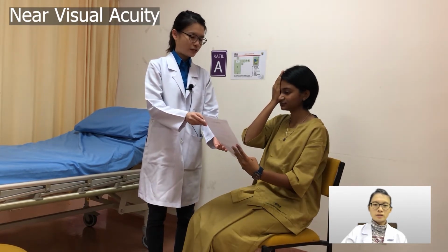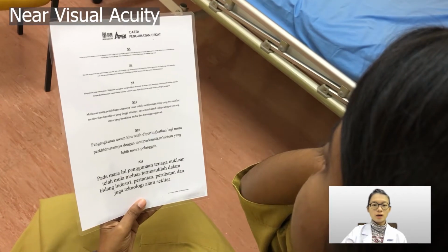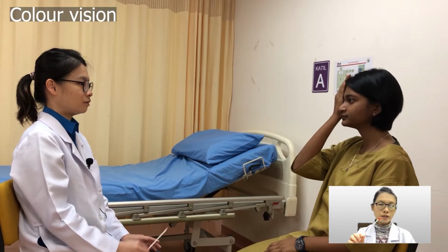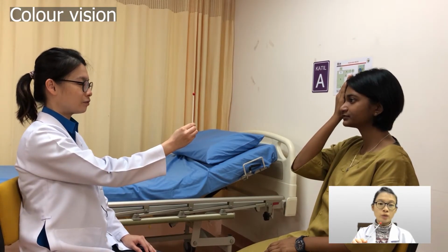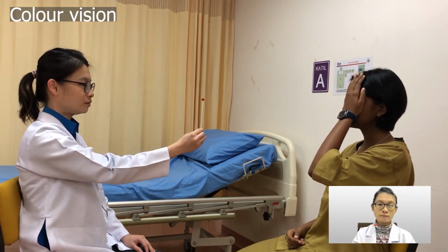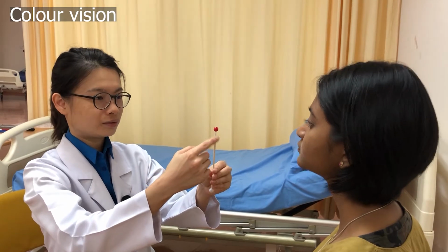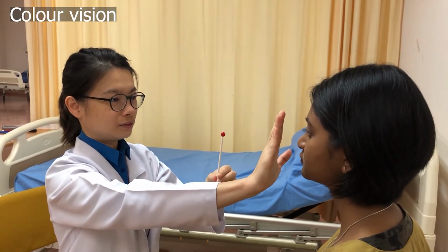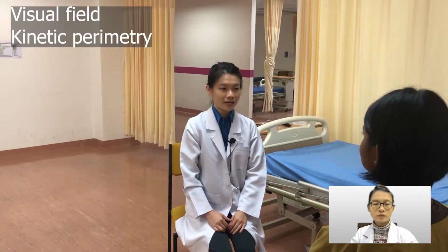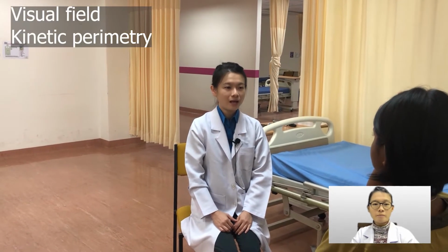Ask the patients to hold the near vision chart at her routine working distance or at a distance of 30 cm. Instruct her to read from top to bottom. Again, test each eye independently. Use a red color pin, and the pin is viewed with each eye independently, and the apparent colors are compared. Look at the red. Is it the same? Yes. Now? Yes.